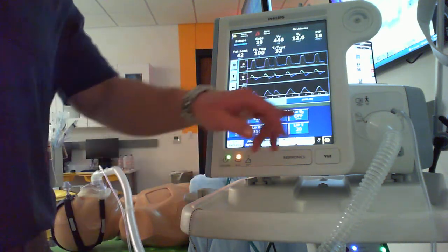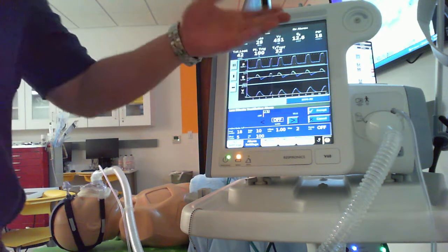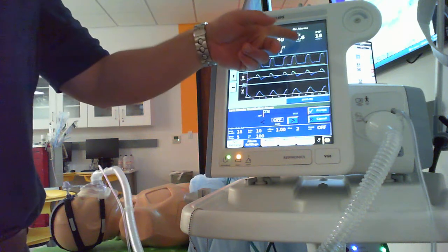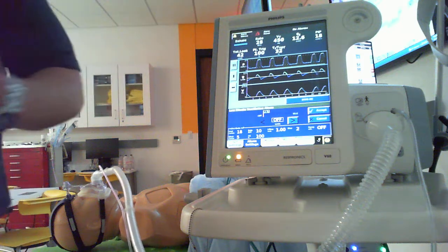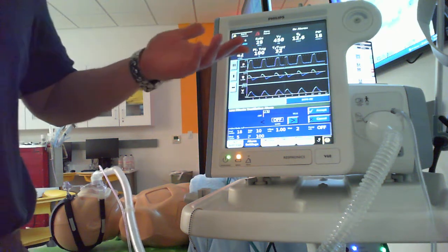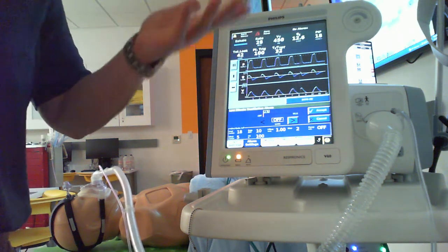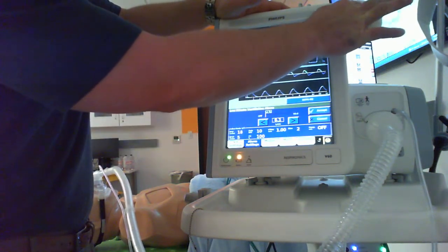Low VE or low minute ventilation, so keep in mind we are not guaranteed tidal volume, we are not guaranteed minute ventilation on this. All right, so what I like to do, really most patients shouldn't be any less than about 5 liters per minute, total minute ventilation. Most people set that based upon this right here, okay? I generically leave this at 5 liters a minute, or you could get more specific and set it at their 100 mil per kilo per minute value. So this patient, 70 kilos, about 7 liters a minute should be his expected base right there. So you can set it at 5. You should really never probably set this lower than 5 for most adults.